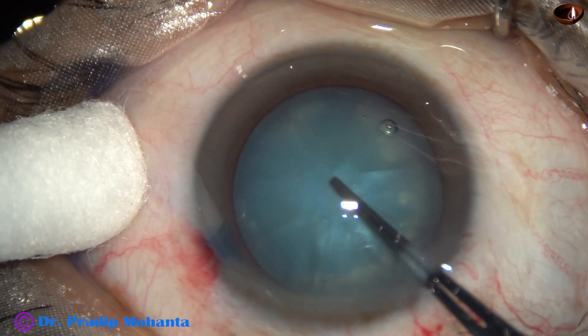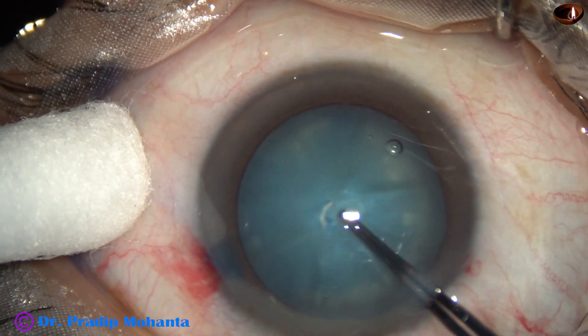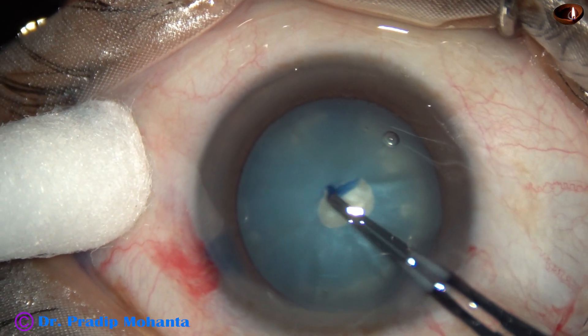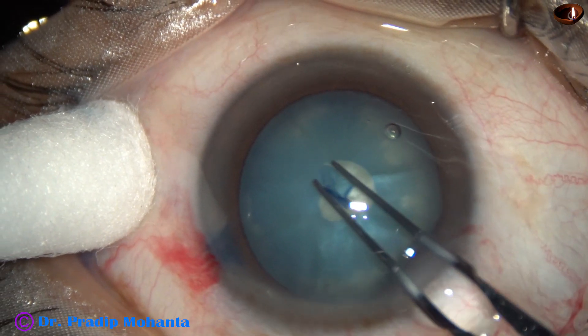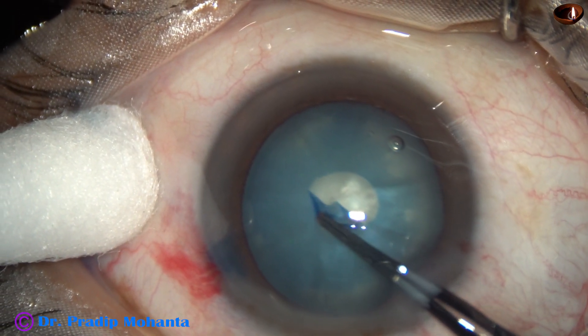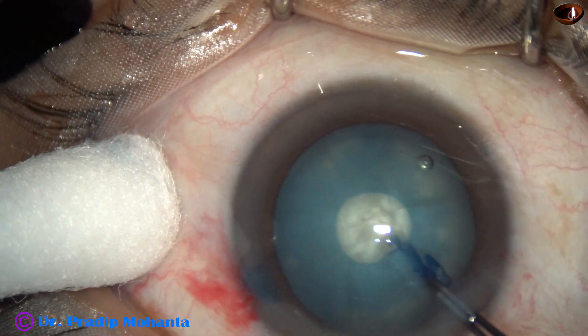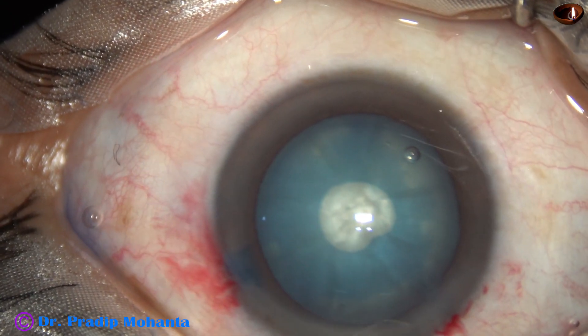And now capsulorhexis. I am using Utrata forceps. I make a C-flap, hold the C-flap, and do a small rexis first. This is Mohanta's minirexis, performed using only hydroxypropylmethylcellulose.